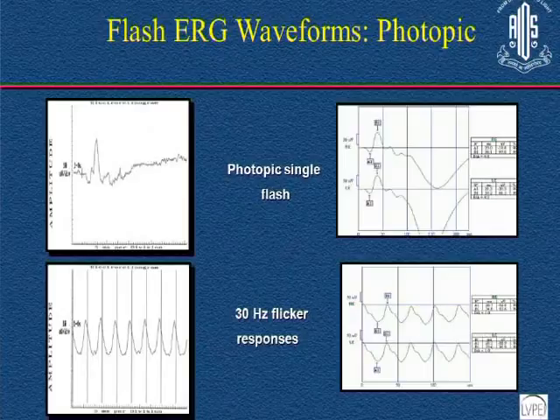I'll be showing some places where just by looking at it you can know it is delayed because it is coming in between two flashes, or it is coming after the flash. Those straight lines are telling the flash. Same way in the other machine. You need to see whether the waveforms are formed well, following a good pattern, or they are distorted. If they are distorted, then you know it's abnormal.